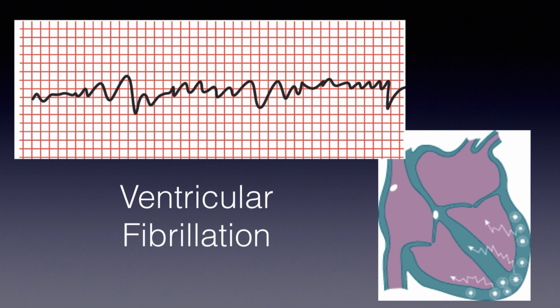And because different parts of the ventricles are trying to contract at the same time, it's very disorganized and there's no movement of blood out of the ventricles. So it's just sort of sitting there quivering. And that's the indication for this. This is when we'll use an AED.